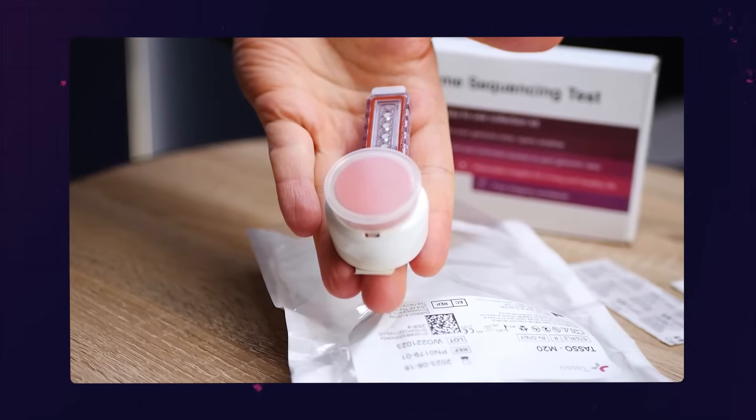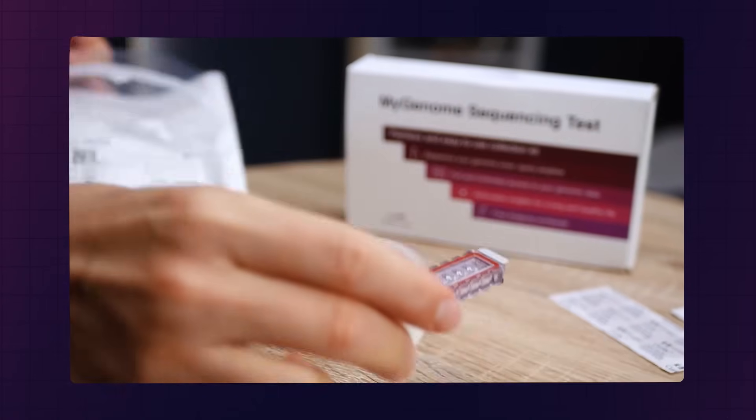The evolution of such at-home blood draw devices has been magnificent. About a year ago, we tested a TASSO device which was different — it was bigger and it collected dried blood samples. But collecting real blood samples would be a game changer. Laboratories will have to find a way to measure any major biomarker without the need for huge amounts of blood, but if they can solve that, the other technology we need at home to collect blood samples is already here.